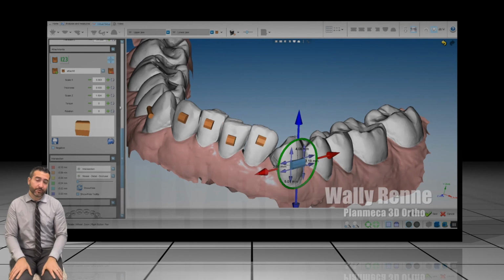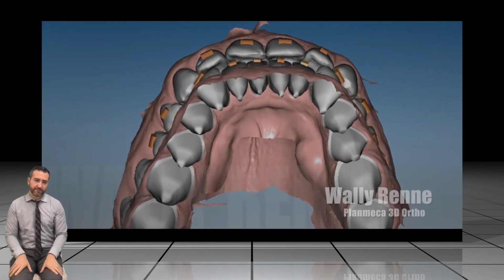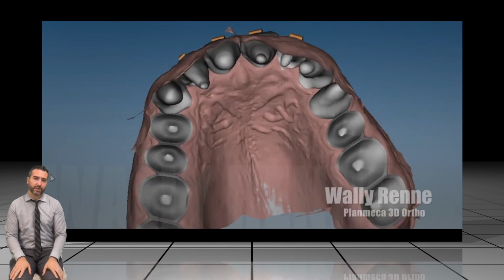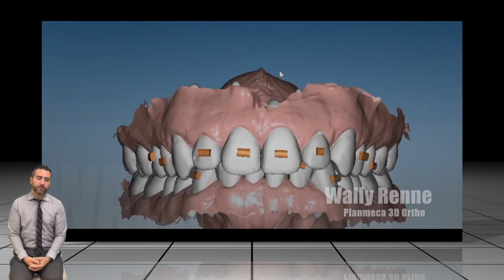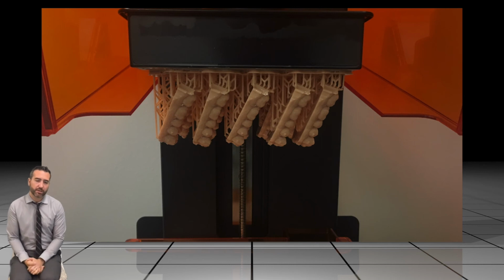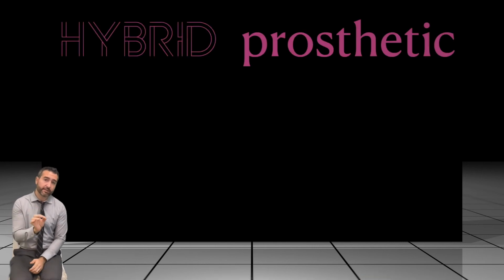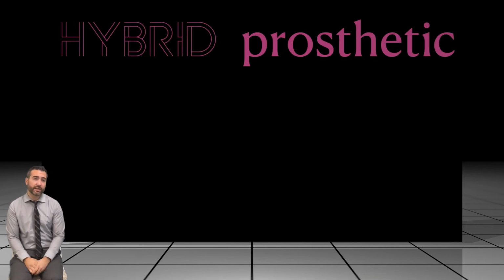I see a time when we're just going to hit a button. In fact, it's already really here. The software does everything for you. You're able to show the patient before and afters, and then off to the printer where you're 3D printing something called aligner bases, where you're going to 3D print these, in this case, on the Formlabs here, and we're going to do positive pressure suck down on these to make our own clear aligners. There will be a day when you actually could 3D print the actual clear aligner itself, but nobody's really doing that right now, not even in your major services.